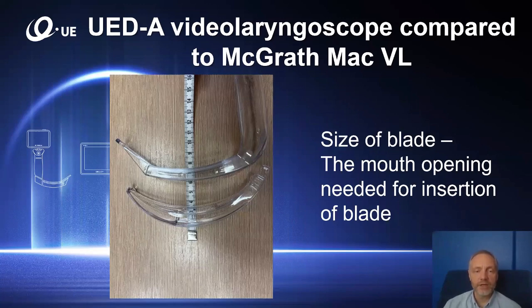Another interesting issue is the size of the blade, the diameter, and this determines the mouth opening that is needed for insertion of the blade. On this picture, you can see that the single-use blade for the UED-A video laryngoscope is thinner than the single-use blade for the McGrath-Mag video laryngoscope.